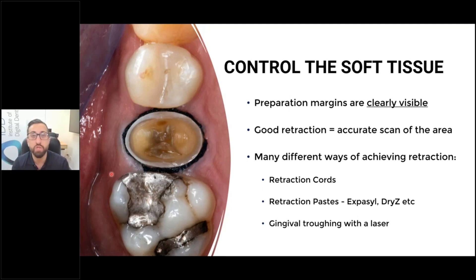I'll keep placing retraction cord until the soft tissue is no longer overlapping on my tooth preparation, because if it is, we're going to have an issue with the scan. The scanner cannot scan around gums — it's not like impression material where we used to have it in a syringe and squirt it past the gingiva and past the tooth preparation. A scanner is just a camera and it will pick up what you can see. The other benefit about retraction cord is it also helps you control bleeding and crevicular fluid.